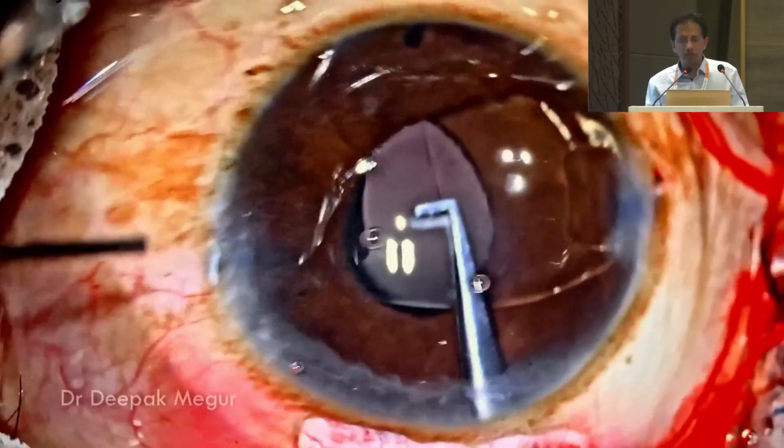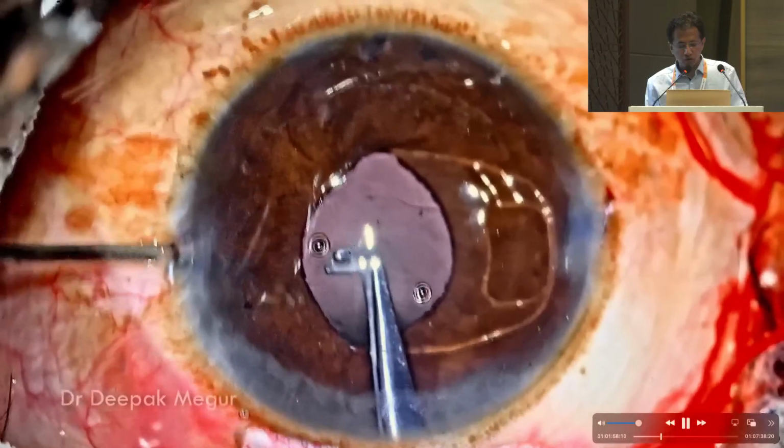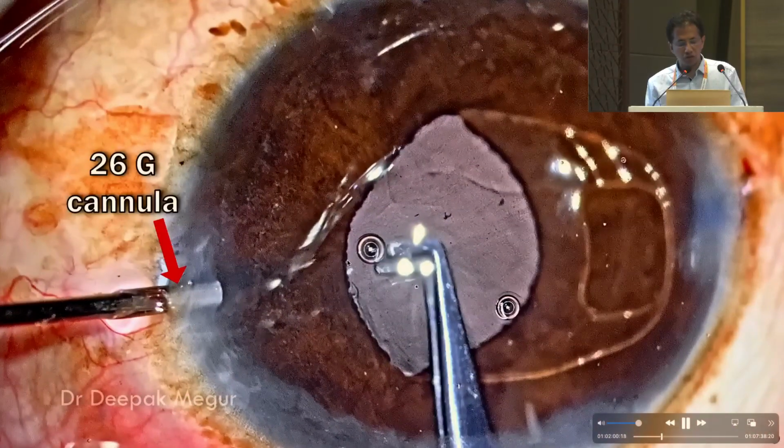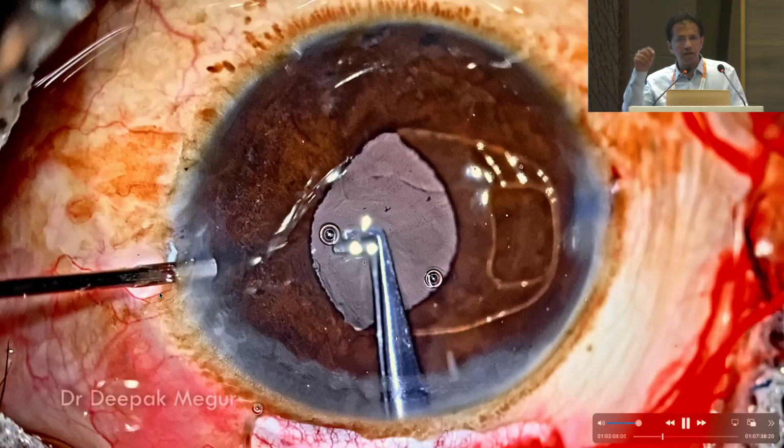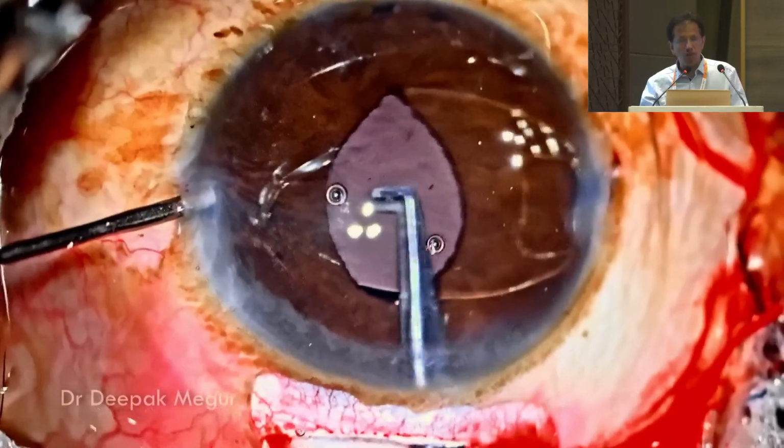So this is one trick which I would like to share with you, because otherwise you don't know where the notch is; looking at the position of the claw of the forceps, we know. And this I picked up from Dr. M.S. Ravindra, to use a blunt cannula rather than a Sinskey. It prevents making a hole in the iris.